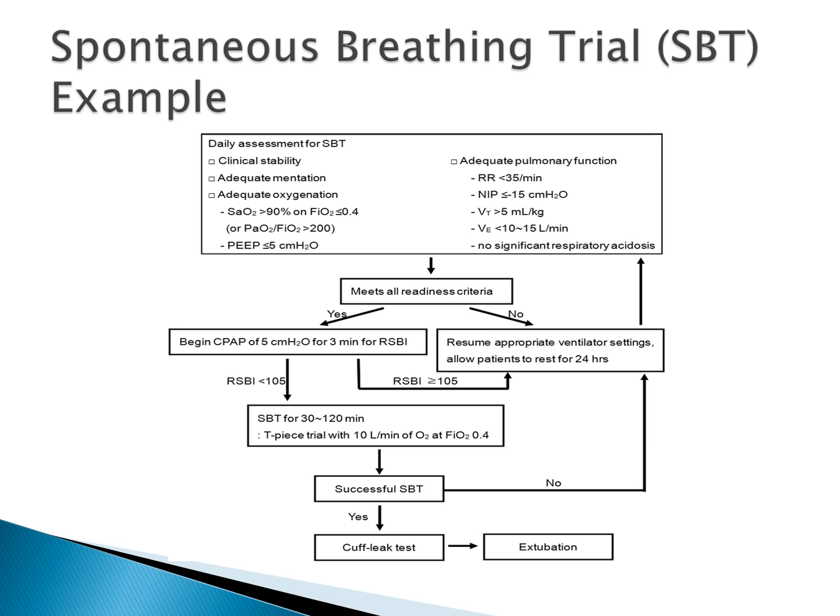And then you're determining whether or not it was a successful spontaneous breathing trial, whereas all the criteria were met, including the RSBI. And then perhaps you're looking for a cuff leak. I say perhaps because most patients that have had the tube in for a short time, 12 hours, 24 hours, are really not going to have a lot of issues unless it was a traumatic intubation. Still a good idea to do the cuff leak.